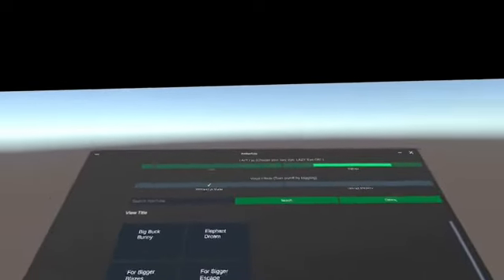And another place where Amblyotube really shines is building environments, okay, the environments which you use with the red and blue glasses, right? So if you use red and blue glasses, you can build environments where you can selectively show or not show some objects based on their color. So if there is an object which is red in color, it will not be shown in the eye which has the red shading, right? And this is what the red and blue glasses, or the anaglyph glasses, are specially used for, where you can create some environments where the objects are either red or blue in color, and you can selectively display or hide the objects from one of the eyes, okay.